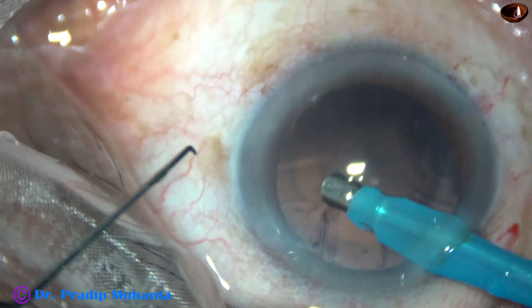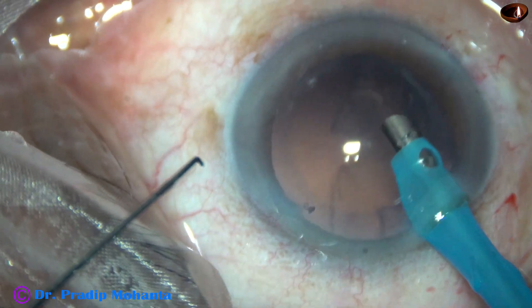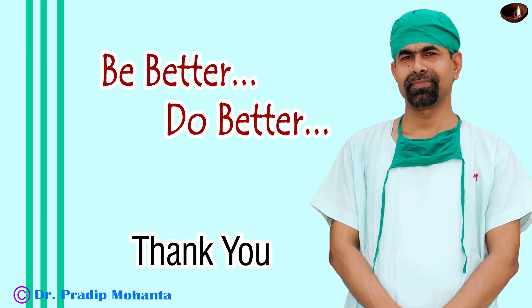Thank you very much for your attention. Hope this video will encourage you to use another instrument in your phaco surgery — that is a pre-chopper, particularly for soft cataracts.